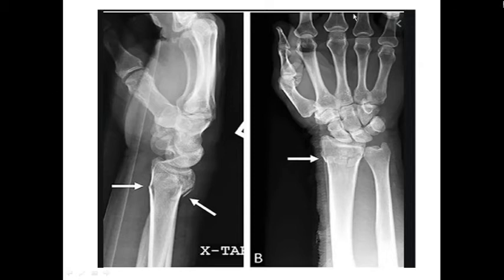Today we'll look into various X-rays which you may or may not get in your exam, in your table vivas. Am I audible to you all?